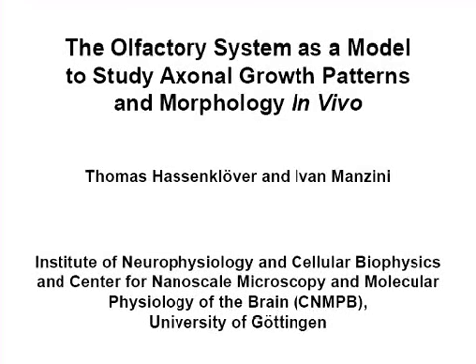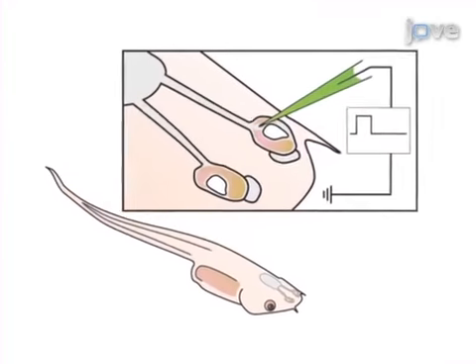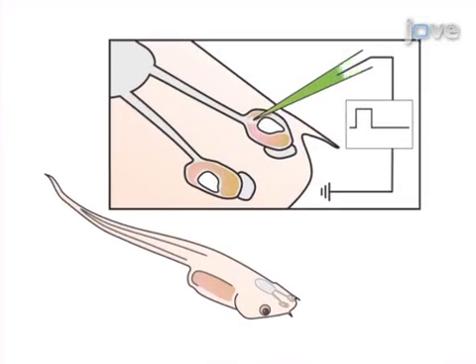The overall goal of this procedure is to label olfactory sensory neurons in vivo to visualize axonal morphology and development. This is accomplished by first electroporating fluorophore-coupled dextrans into single olfactory sensory neurons. The second step is to wait 24 hours to allow the dye to spread into the axonal processes of the sensory neurons.